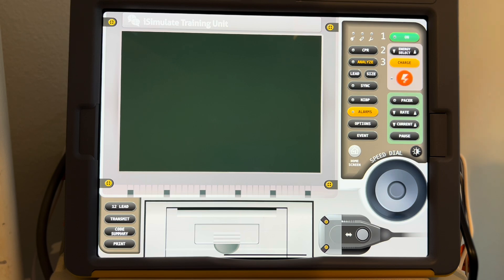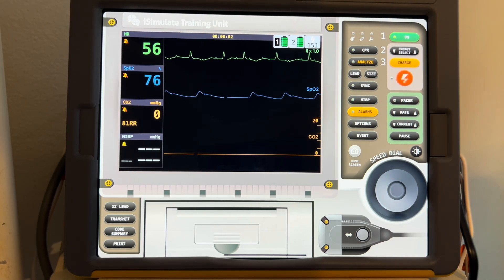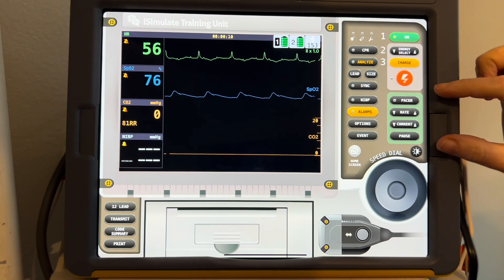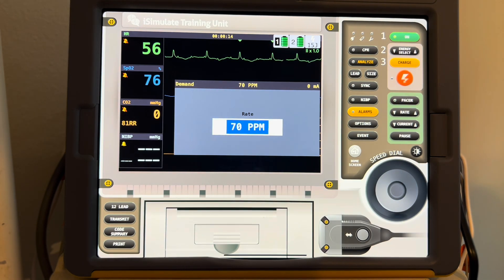It's time to turn your defibrillator on for the use of mechanical pacing. First, you start with this green button here. Once the machine is powered on, you should see your rhythm as shown here. Next, you're going to need to turn your pacer on. The pacer on this defibrillator is everything in green, so you would hit the pacer button. That turns your pacer on.